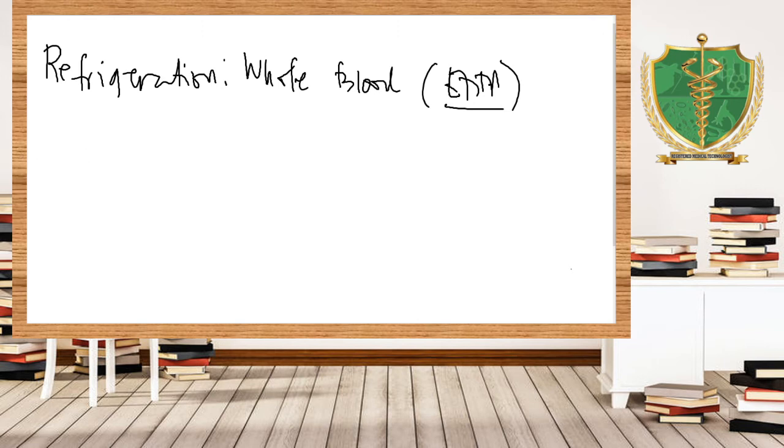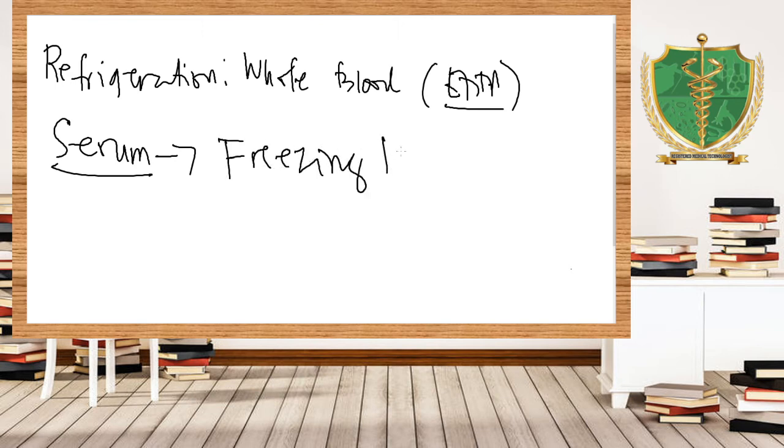Since serums, diba sabi natin si serum, yung ating most commonly used sample in chemistry, serum must be preserved, no, in freezing temperature. Okay? Bakit po? No, bakit kailangan freezing temperature? To preserve the specimen. Kasi, for example, glucose or the glucose.